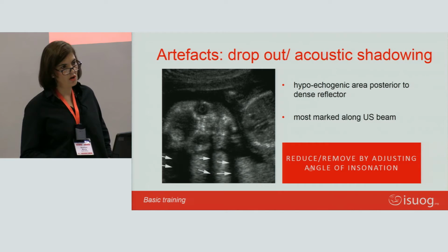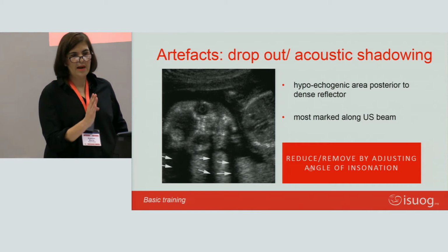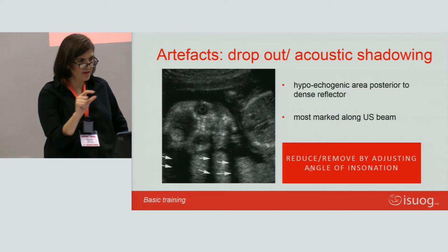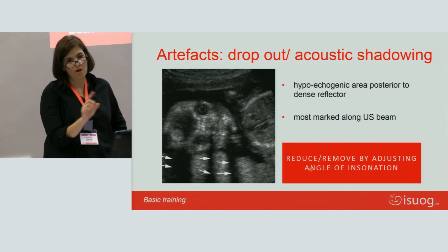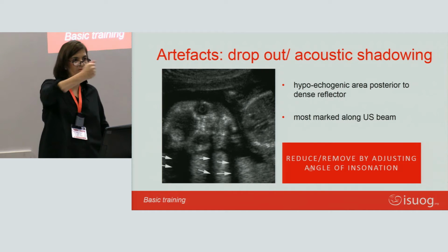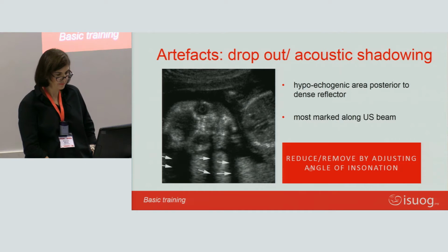The same is so when you're examining the fetal heart. If the heart is completely in an apical view and the ultrasound beams are coming down the septum, you often get an area just below the valves where it looks like there could be a VSD. But if you come with your transducer from a different angle, then you can see that the septum is actually intact.